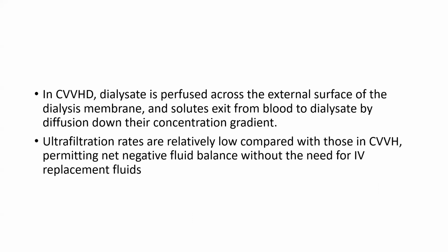In CVVHD, dialysate is perfused across the external surface of the dialysis membrane, and solutes exit from the blood to the dialysate by diffusion down their concentration gradient. Ultrafiltration rates are relatively low compared with those in CVVH, permitting net negative fluid balance without the need for IV replacement fluids.